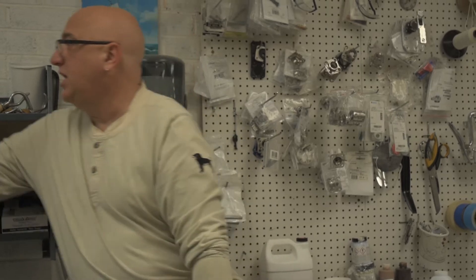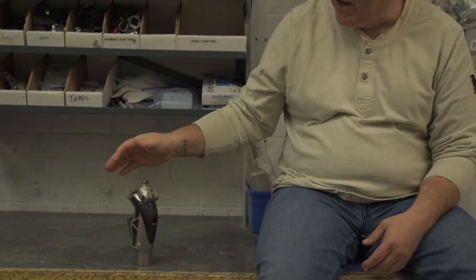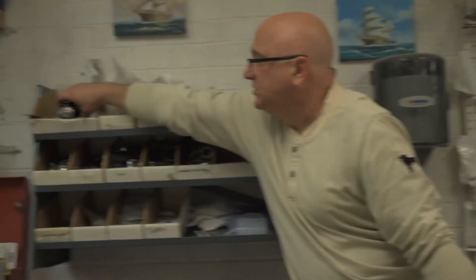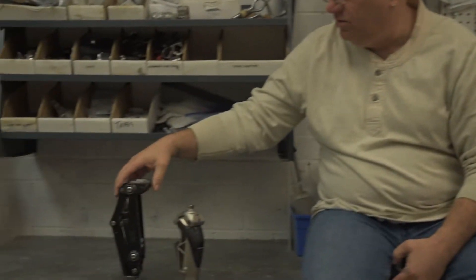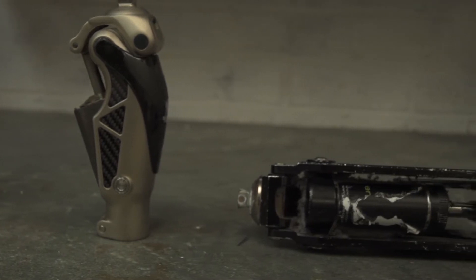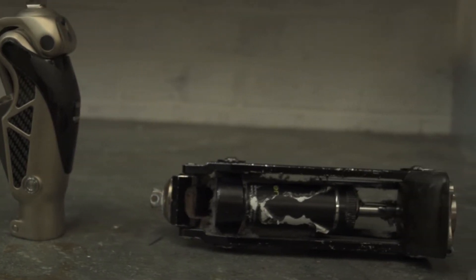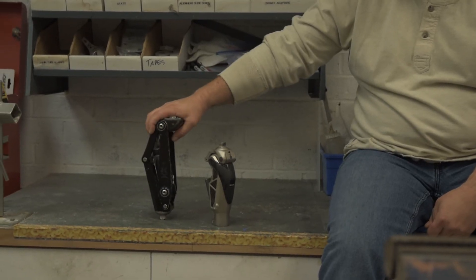Some of the knees we have are for a patient who is less active — maybe an older person who just needs more stability. And then this type is for a fairly active person. This is a hydraulic knee unit and you can run on it and do all sorts of good things, but it's super heavy duty.